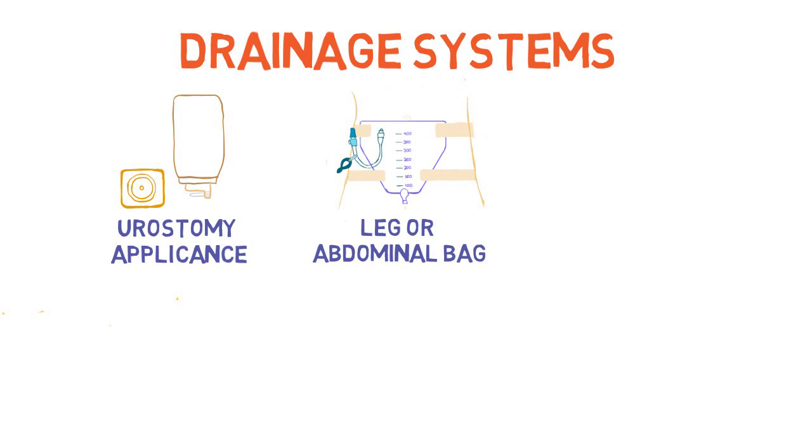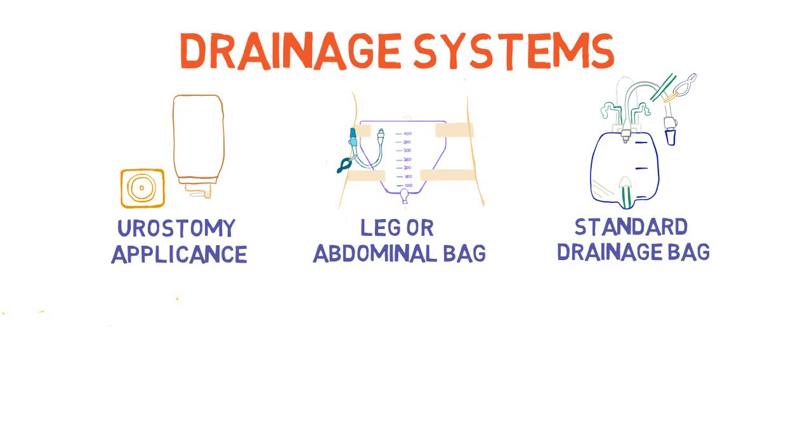These leg bags or abdominal bags are very useful, but do not function well at night. The traditional urinary drainage bag is 2 liters and is often used for hospitalized patients or as a nighttime bag for patients with long-term indwelling catheters.